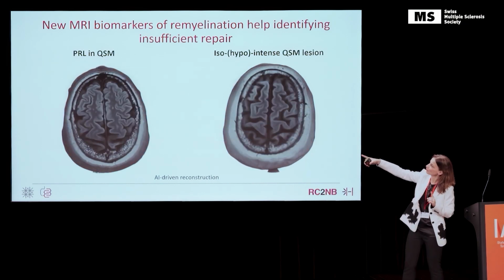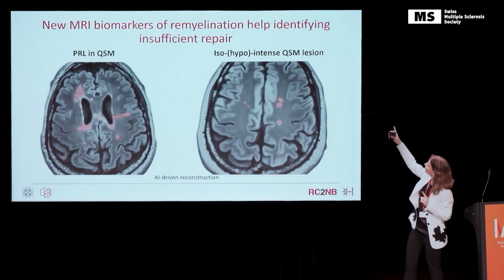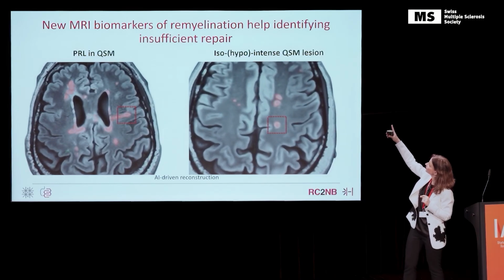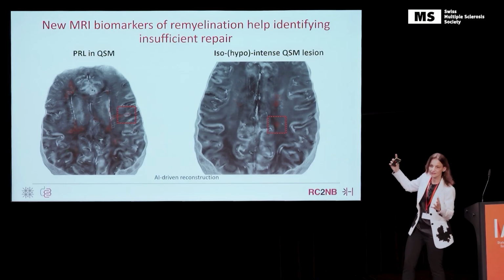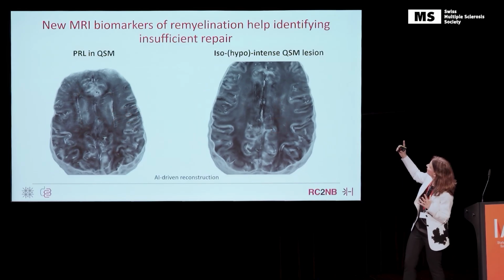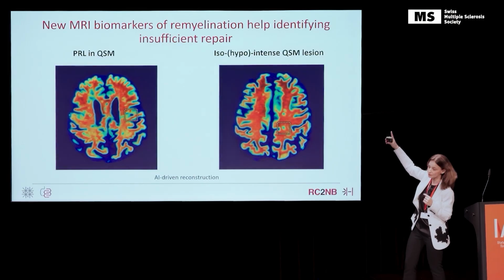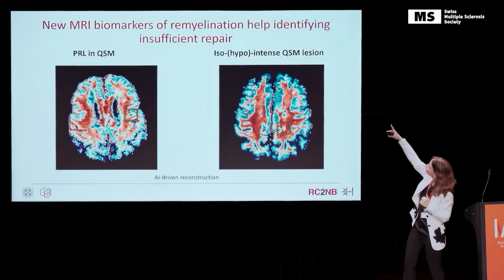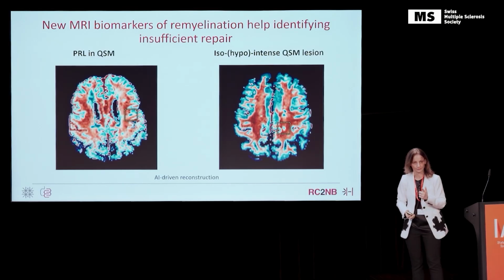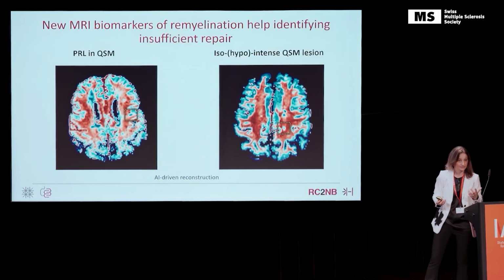Voila. So this is what we know we have already seen with the bad lesions, and this is another brain where I want you to focus on another lesion, the red one. If you look at the QSM map, we don't see it. It's iso-intense. And now if you look at the myelin map, you see that it's greenish, it's not as bluish as before. So the myelin content is less, but not too much less. And the same holds true for the axon content. This observation let us investigate these lesions.